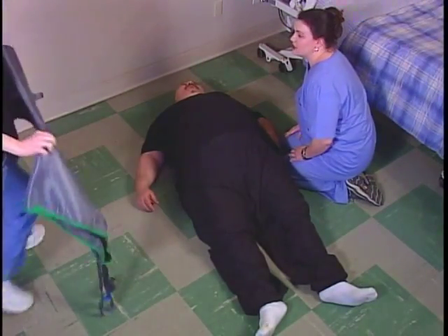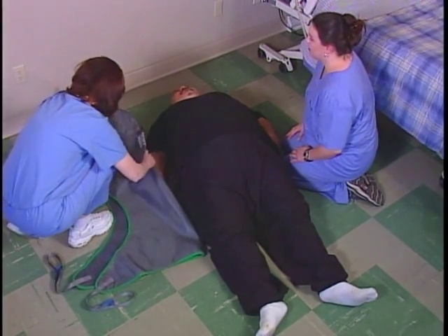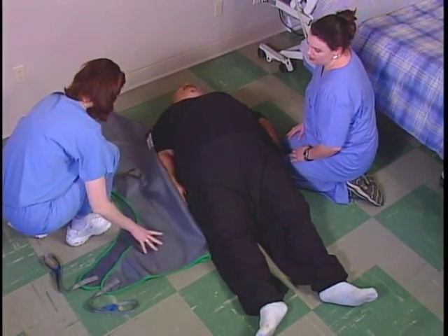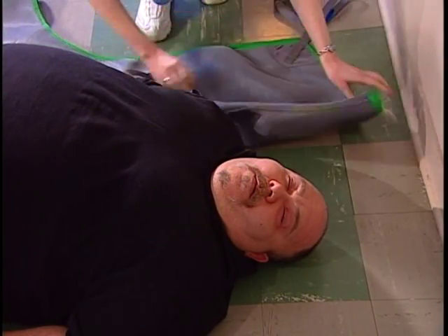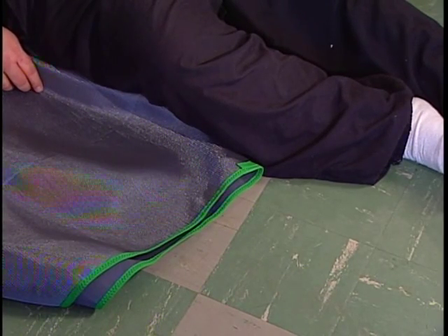Just relax. First, we're going to get the resident into the full body sling. It requires two people. Okay. Fan fold the sling and set it down next to the resident. The top edge should be slightly above the resident's head, and the bottom edge should be just above the knees.